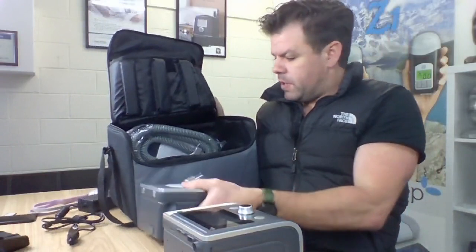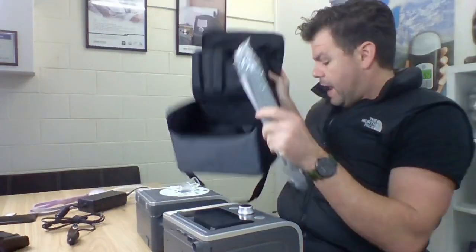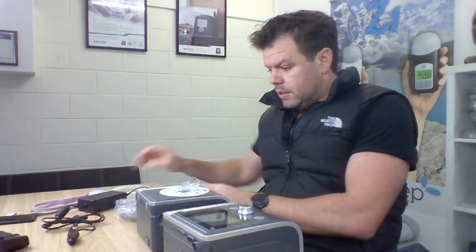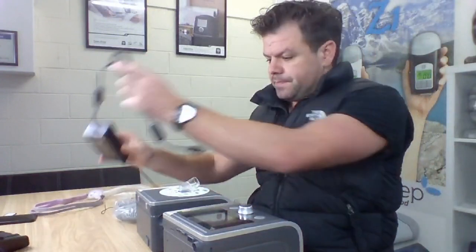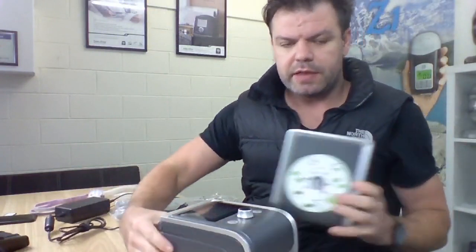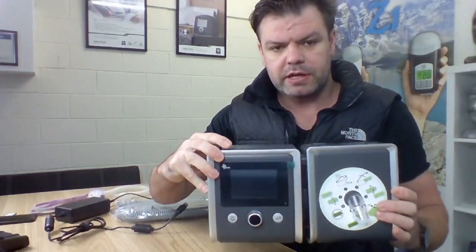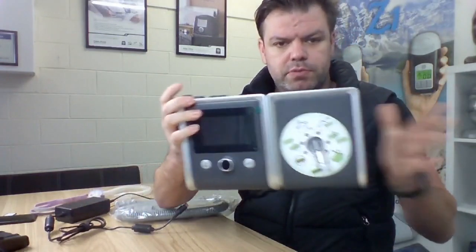So the components I'm going to need here are the tubing, your machine, your humidifier, and I've already got the power cord set up here. The very first thing we're going to do is put the two pieces together. We have our humidifier section over here, and then the section that has the screen and the buttons on it. We're just going to push them together to click them.